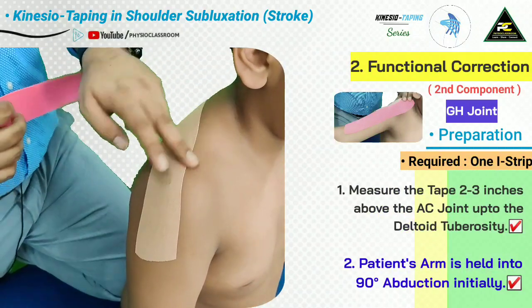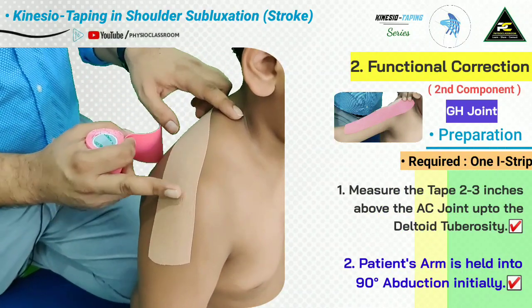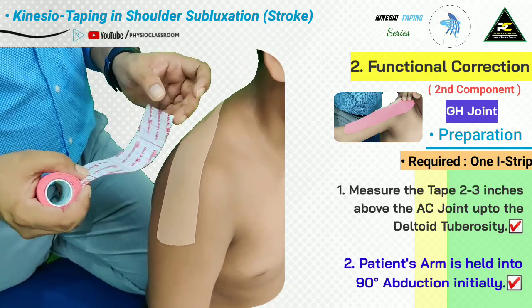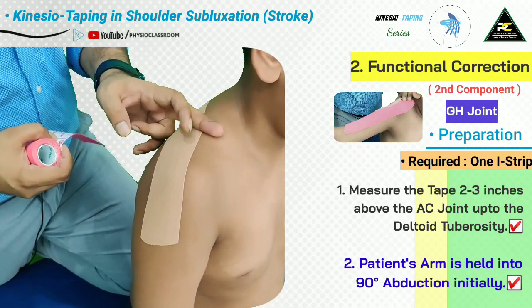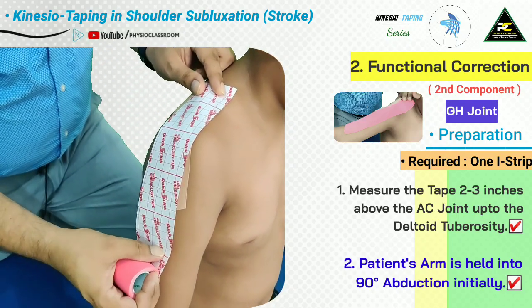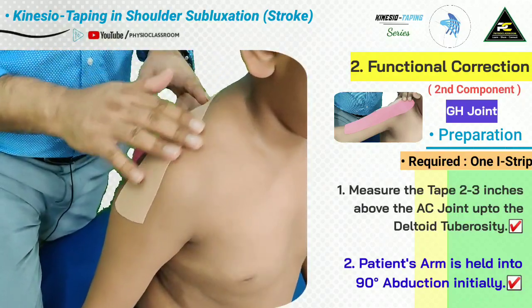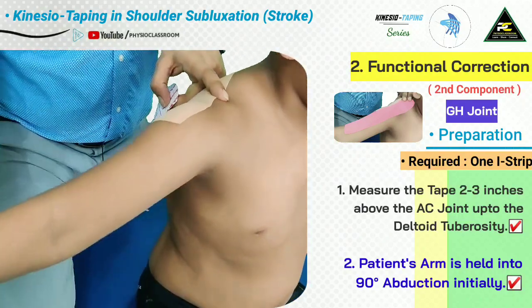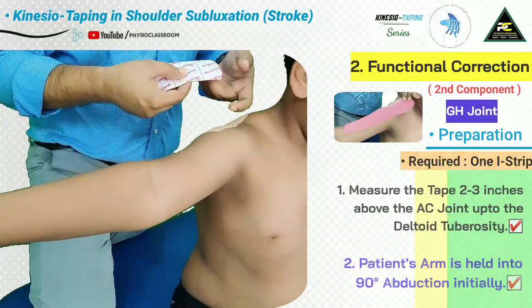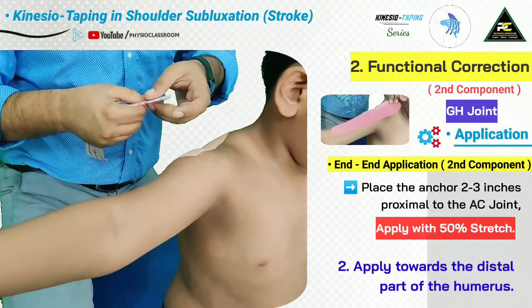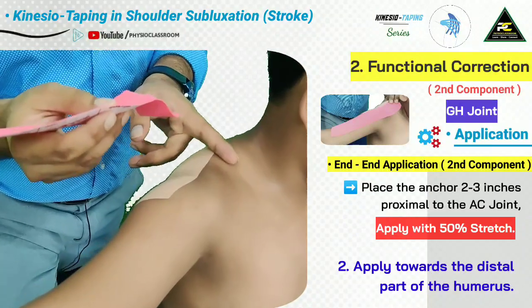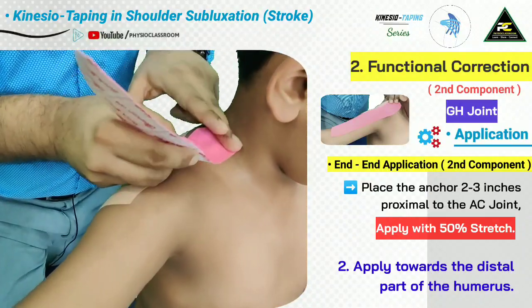The second part of the kinesio taping application addresses the functional correction of the glenohumeral joint. For this, we measure the kinesio tape from around two to three inches proximal to the AC joint up to the deltoid tuberosity. The patient's shoulder is abducted to around 90 degrees, which needs to be done with the help of another person. We then tear the anchor from one end and apply it around two to three inches proximal to the AC joint.